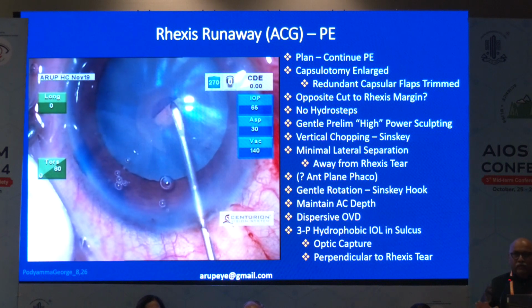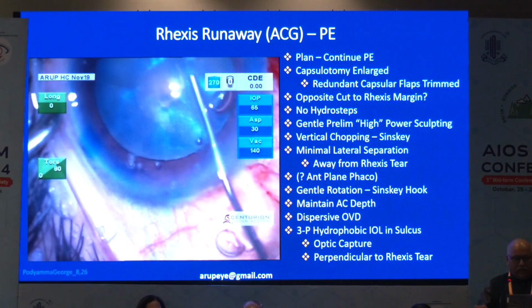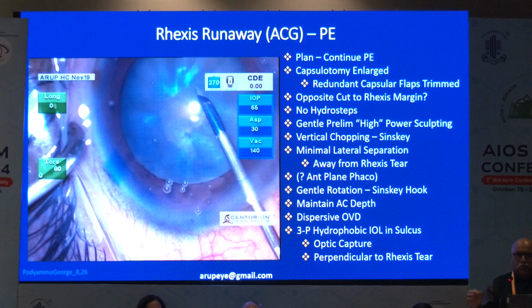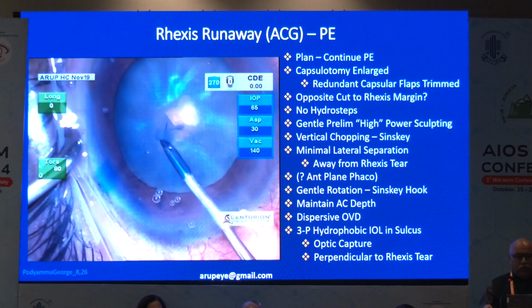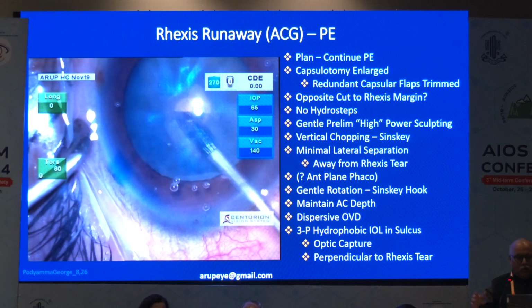So ideally you would have tried to perform a combined surgery for this case, trab plus phaco. So here, I just decided on cataract surgery. This itself is going to be a challenge. So we always do a 2-step phacoemulsification in these situations. So this first stage is very crucial, because if it runs away to the periphery, then your whole surgical pathway is going to be altered.